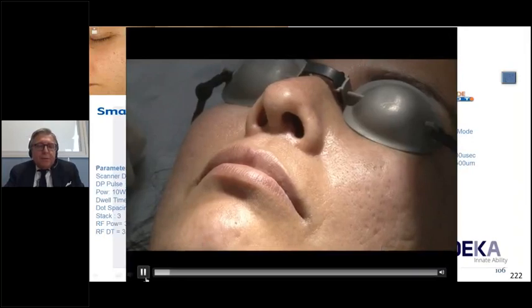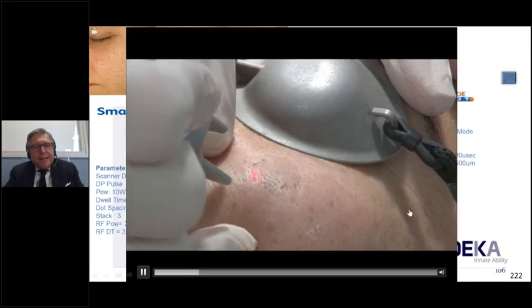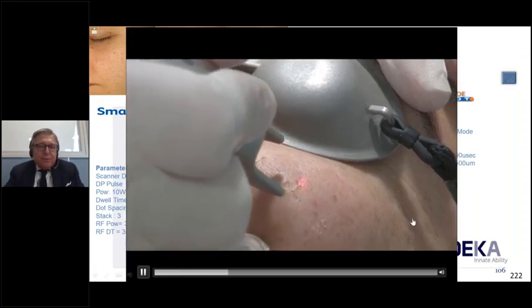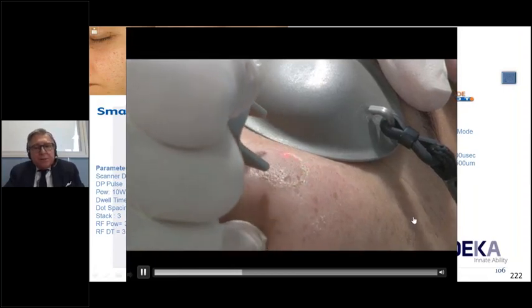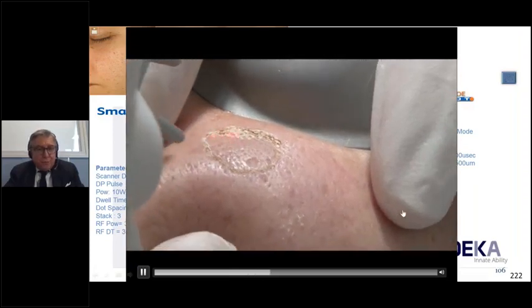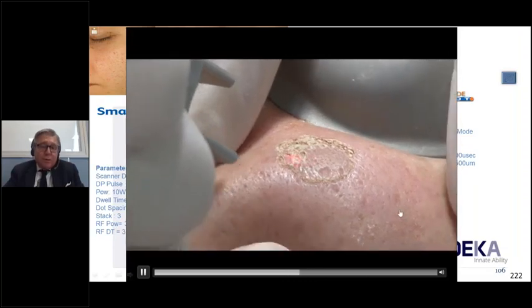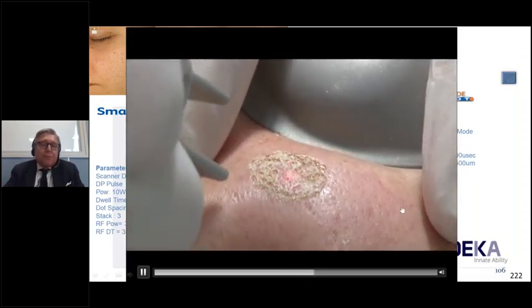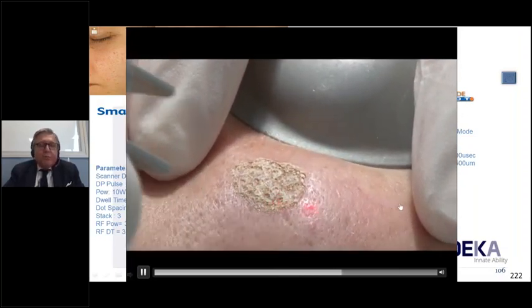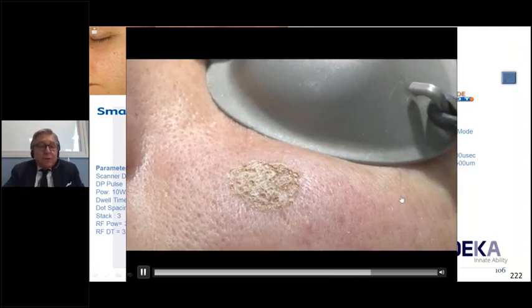This is one of the examples when we use the freehand to vaporize the edge of the deeper acne scars, the deeper depressions, in particular the surrounding areas of the depression. Why is it so important? Because we can combine the freehand, so the surgical mode for vaporizing, for ablating the edge, the wall of the atrophies, but then you can use the fractional at the same time.